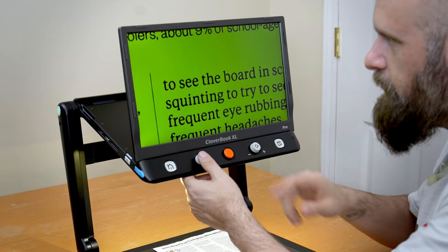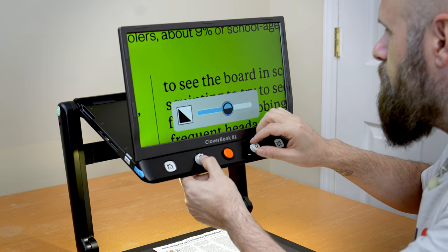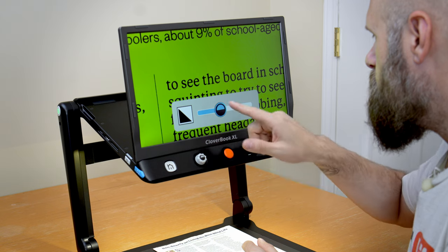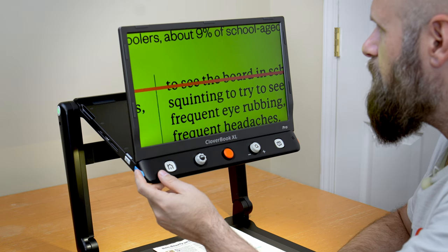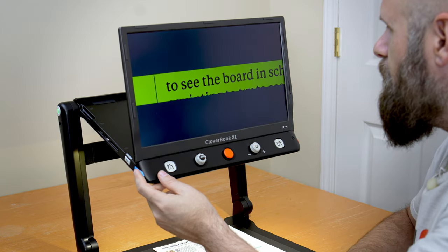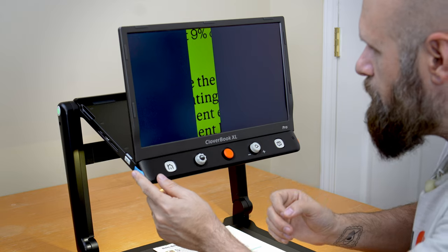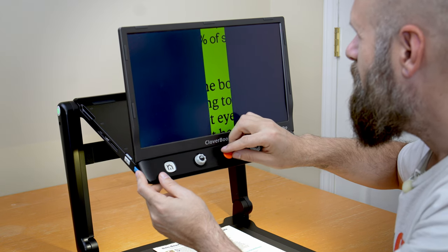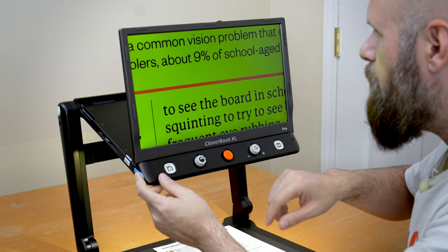To adjust contrast, hold down the color button and rotate the magnifying dial. You can raise or lower contrast using the dial or by dragging with your finger on the screen. The lower button on the left side controls lines and blinds. Tapping it rotates through horizontal lines, vertical lines, and masks or blinds. If you hold down the lines and blinds button and use the joystick, you can adjust the size and position of the blinds and lines — move them wherever you need or make them larger or smaller.